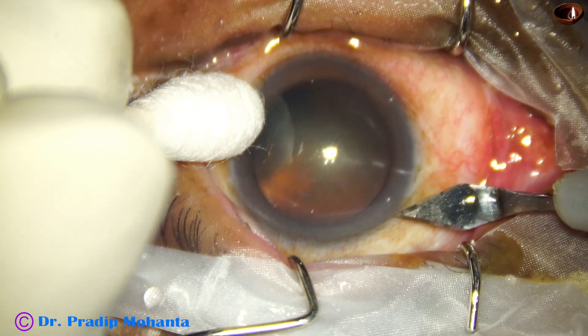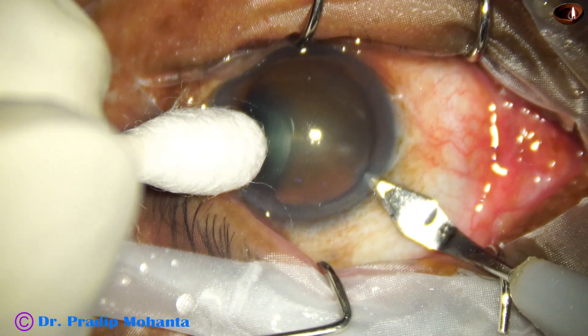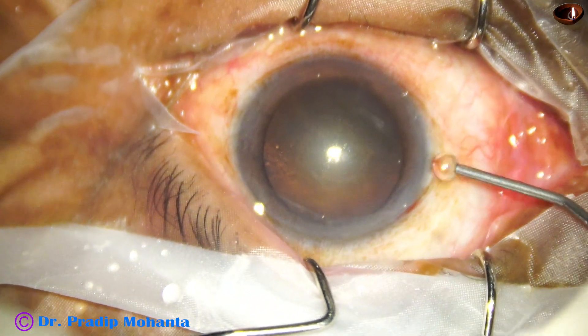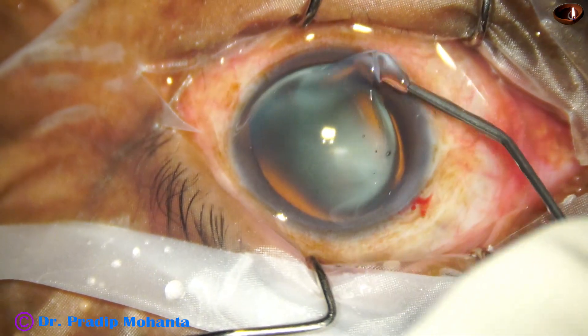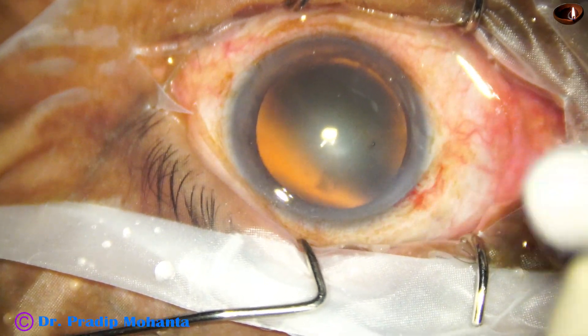This is the main incision with a 2.8 millimeter steel keratome at around 11 o'clock, and now the anterior chamber is filled up with 2% hydroxypropyl methyl cellulose, which is applied over the cornea also to get better visibility.